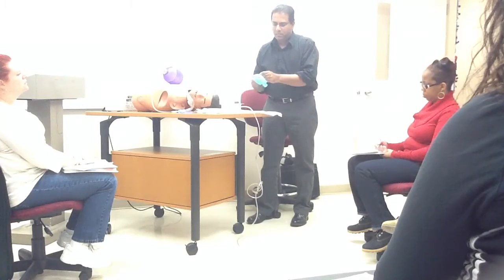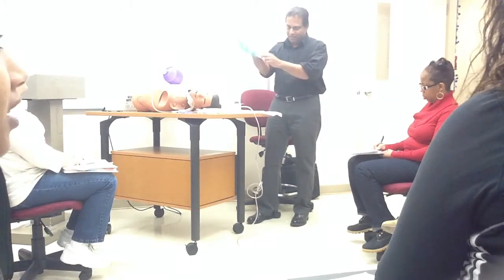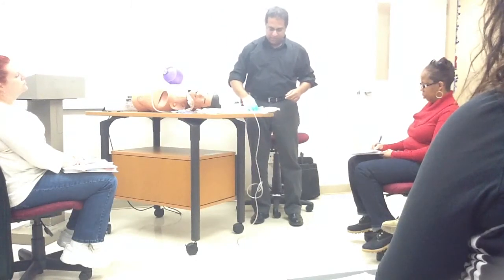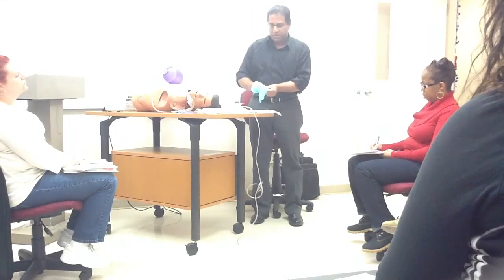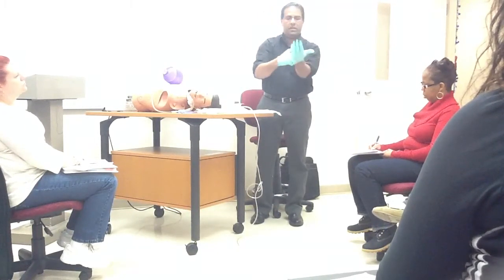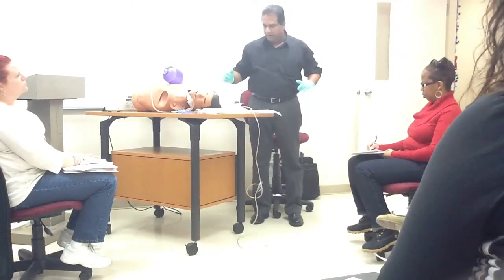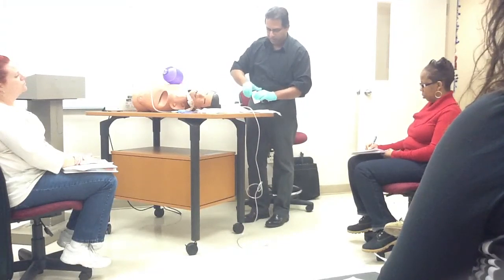It's very small. Pretend that one of these... Well, I got it. So I got this one on and it's sterile, and I can touch this glove anywhere I want now. But I have to slip my hands inside. You see this? Slide it up. Okay. All right. Now, take this.